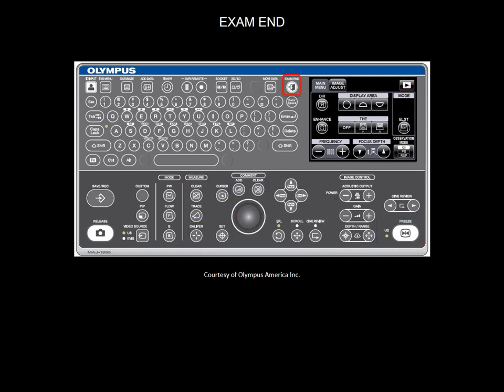If you are performing back-to-back cases and you don't turn off the machine, you will be using the previous adjustment values. Exam End button allows you to go back to the default original setting.